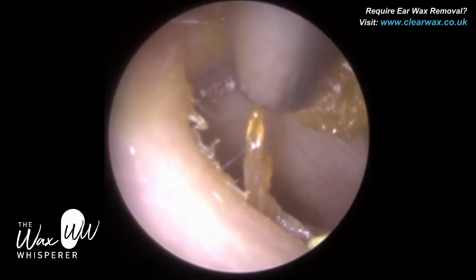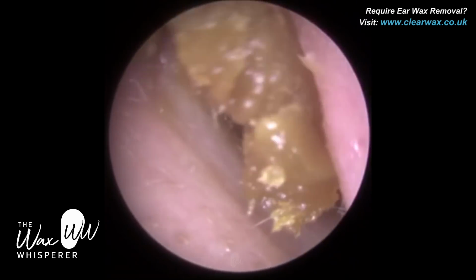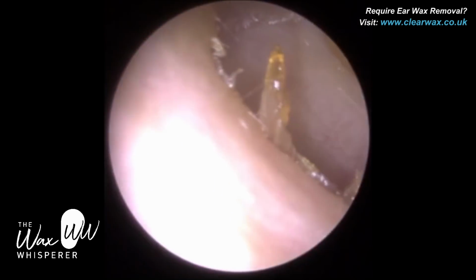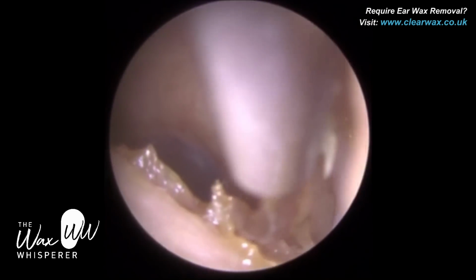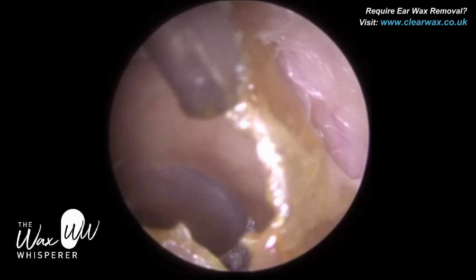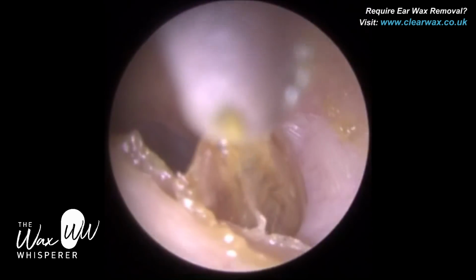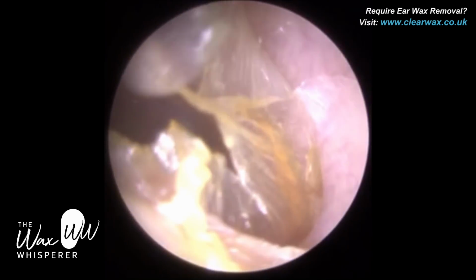So we finished the right ear, we're just on the patient's left ear. With this ear, this is all keratin, it's not wax, it looks like wax but it's not, it's dead skin keratin that's shedded from the eardrum. This skin then migrates outwards like a conveyor belt, like a snake skin, but just near the entrance it's got trapped. And presumably the reason why it's got trapped is because the client's ear canal entrance is very, very narrow, and they have got a twisty entrance as well.